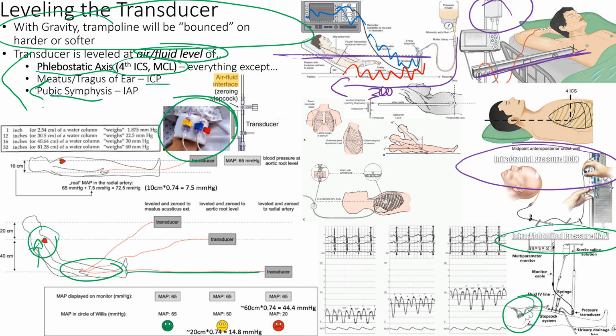It's nice. It's going to be keeping a tab. So as the patient has a pulsation, you can feel that deflection, and that will be translated up the tubing. Okay. So these are differences in your waveform based on whether you are leveled or not leveled, right? So that's the idea behind making sure that we are leveled with the heart and not level with the arm down here. You can see there's a big difference there.